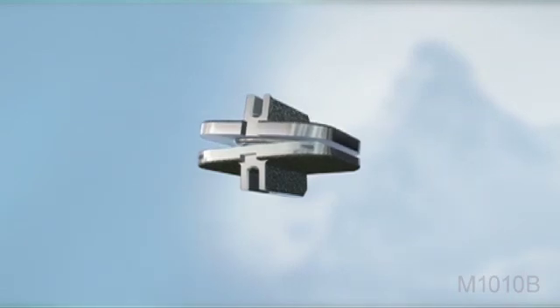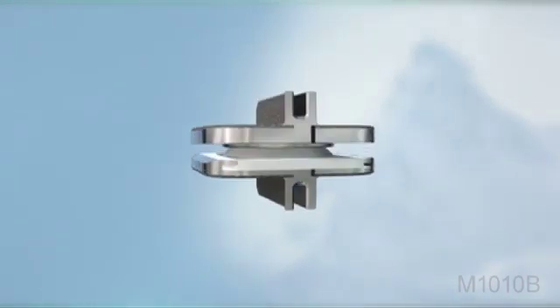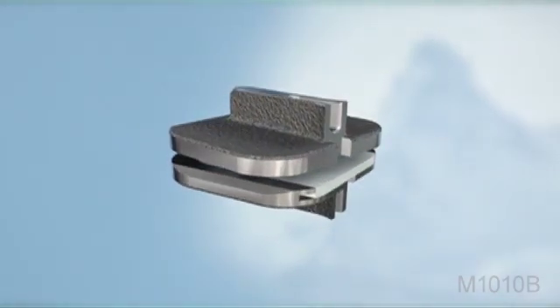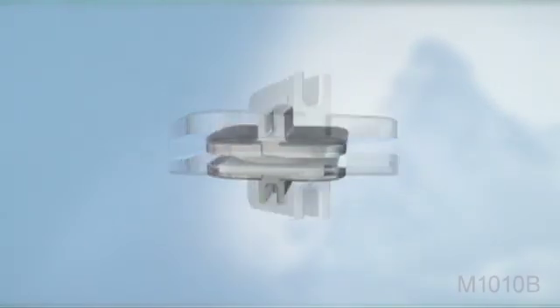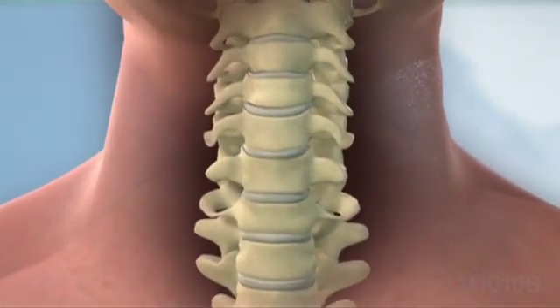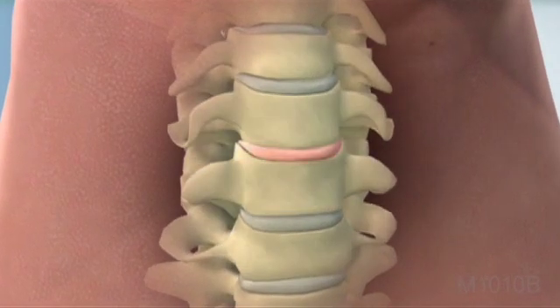The Prodisc C total disc replacement is an FDA-approved spinal implant intended to reconstruct a diseased intervertebral disc in the cervical spine. The Prodisc C is indicated for patients suffering from intractable symptomatic cervical disc disease, or SCDD, at one level between C3 and C7.